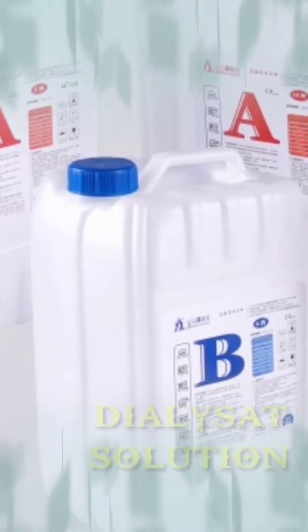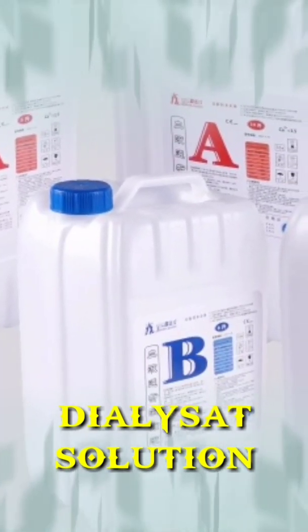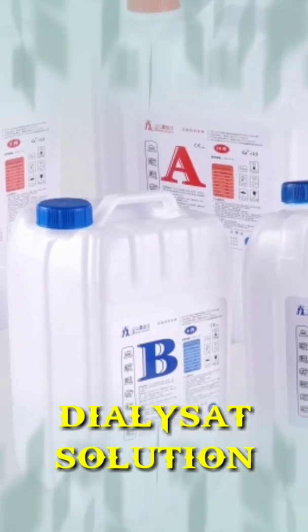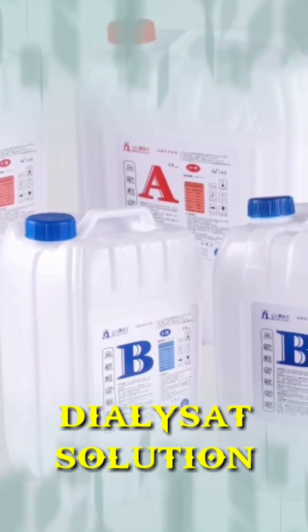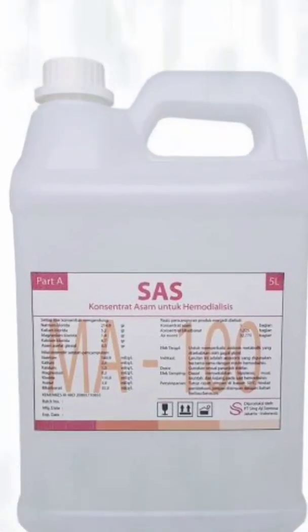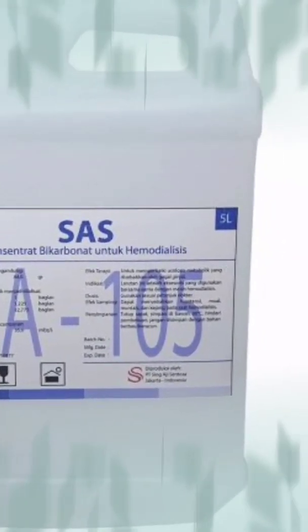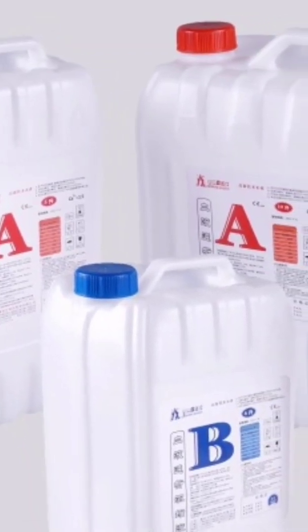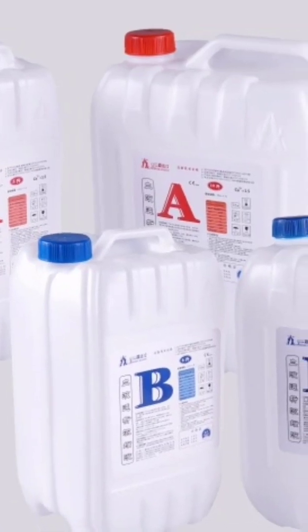Number 3, dialysate solution. Dialysate is a solution containing electrolytes in certain compositions. There are two types of dialysate on the market, namely acetate and bicarbonate dialysate. Acetate dialysate, according to its composition, has several types, namely standard type, free potassium, low calcium, and others.